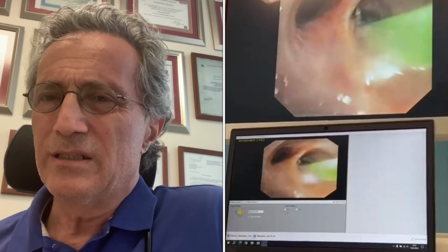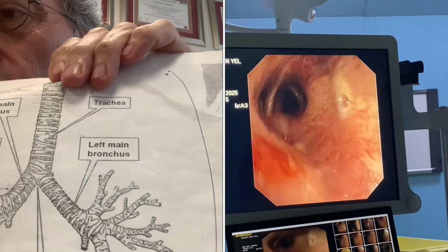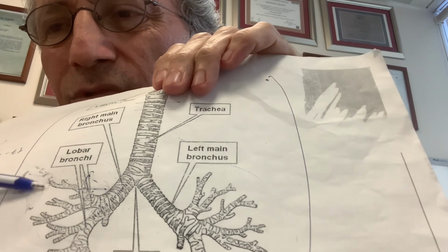The scraping procedure takes approximately 1.5 to 2 hours. The surgeon enters the 10 segments of the right bronchus, then the 9 segments of the left bronchus, carefully scraping each one until the hardened phlegm is removed.